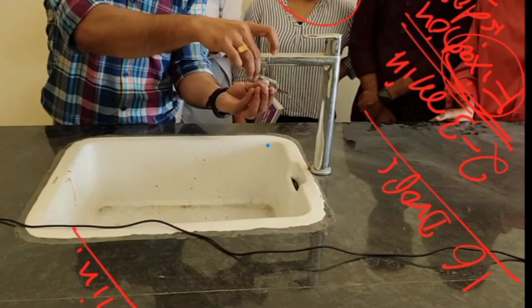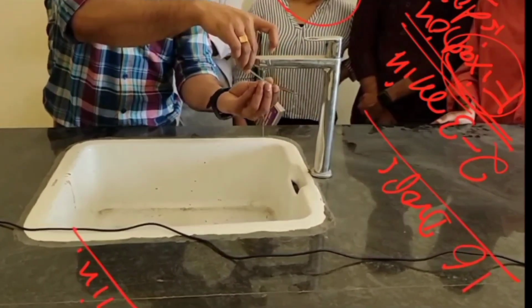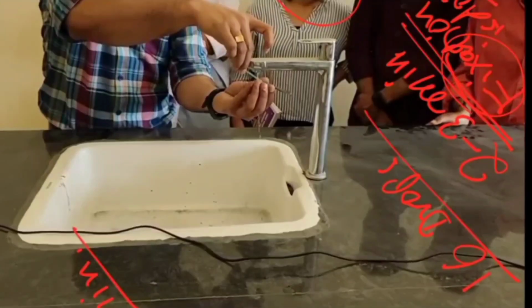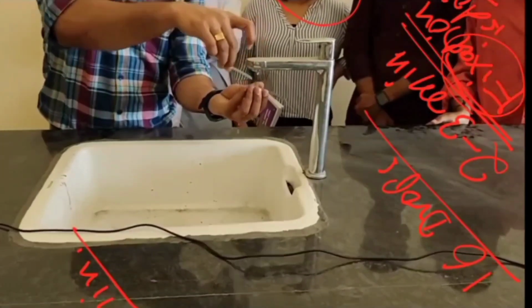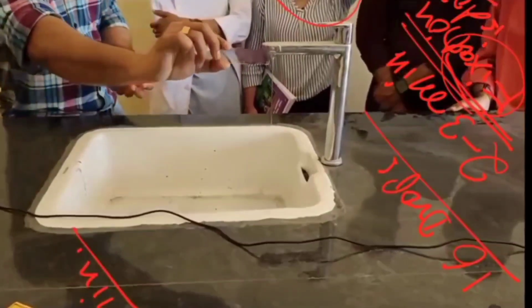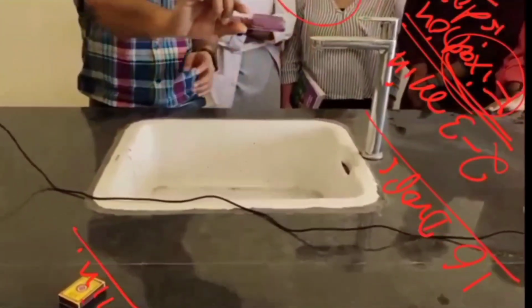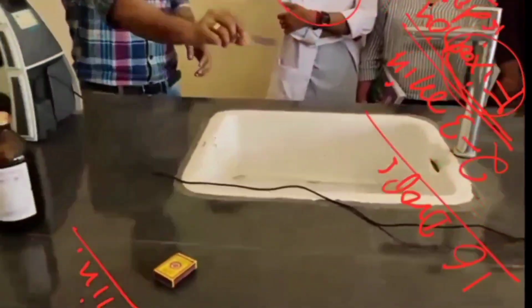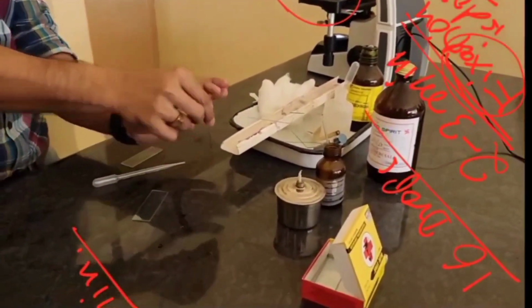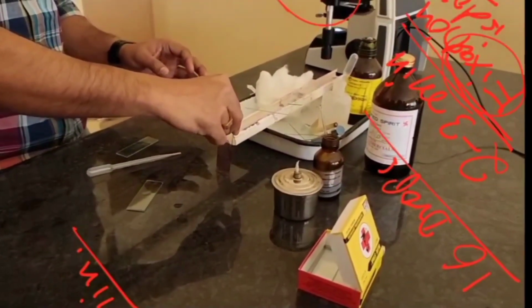Or you can use another slide under the tap, and the water will fall indirectly from the other slide onto your blood film, so it will wash and then appear slightly pink or pinkish blue in color. This color is very good. Now we can put it in an inclined position to dry.